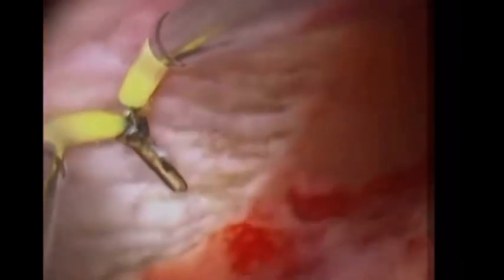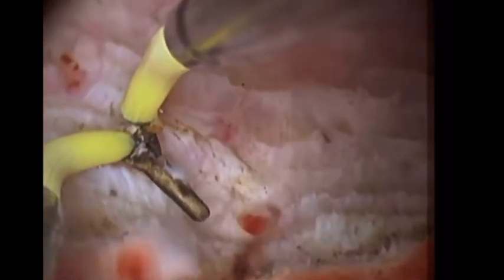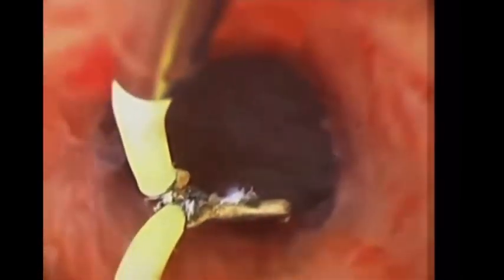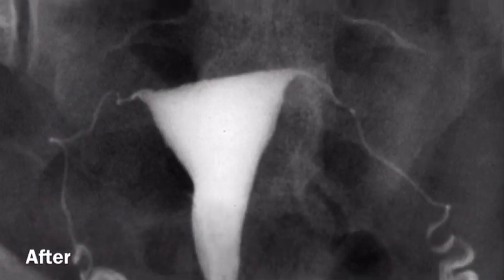The reconstruction is almost completed. The final part near the fundus needs very fine adjustment and cutting. The cut-off limit of surgery is when both tubal ostia are at the same level, guided by the preoperative 3D scan which confirms the thickness of the fundus — don't exceed the level of the two ostia, otherwise you will perforate. Then enjoy the final view and withdraw. This is a non-edited video showing real surgical time. I'm very glad to share the preoperative and postoperative hysterography. That's Osama Shawki from Egypt — thank you very much.